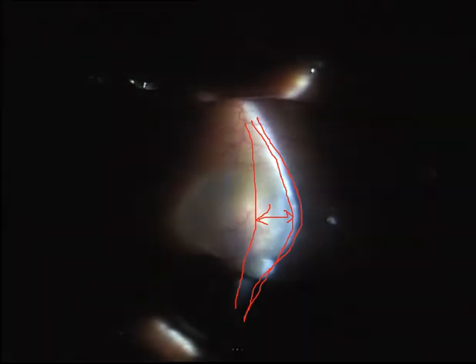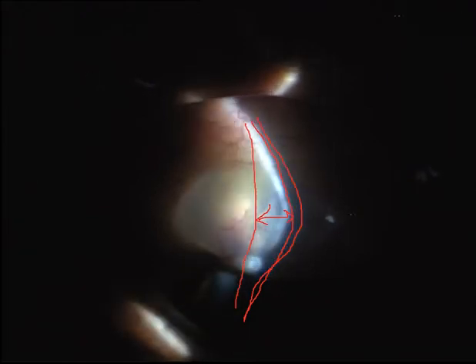Let's move on to higher magnification. Here you can see that thickness as we move across that area. When you're on the sclera there's no thickness, and now you can judge for yourself — you can go from the other side and actually see the bleb on the other side as well. That tells you how thick a bleb is and whether it is functioning or not.